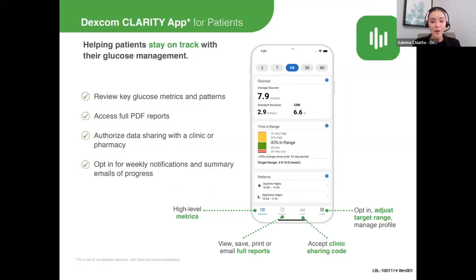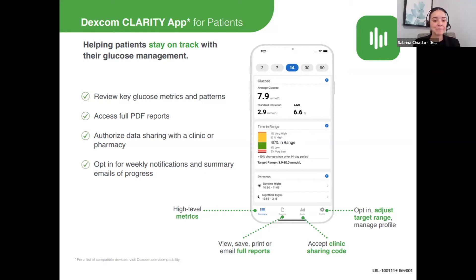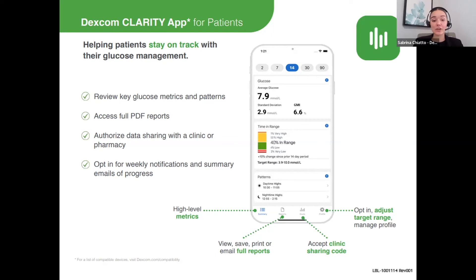After 24 hours, everything is automatically stored on our online software, Dexcom Clarity. Patients should download both the Dexcom G6 app and the Dexcom Clarity app. In Clarity, patients can see their glucose readings from all time, their average glucose, estimated A1C, time in range, and they can even generate countless reports.